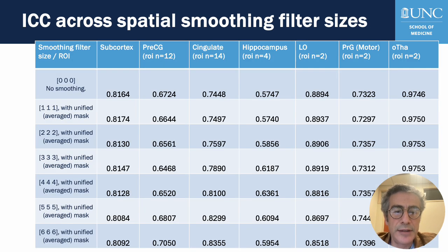Following our test-retest reproducibility measurement, we looked at the subcortical and cortical areas to see how reproducible the myelin content measurements are using the magnetization transfer approach with PETALUTE. As illustrated here, our ICC values are overall at the higher end of the expected values. So this demonstrates that these measurements with PETALUTE are reproducible.